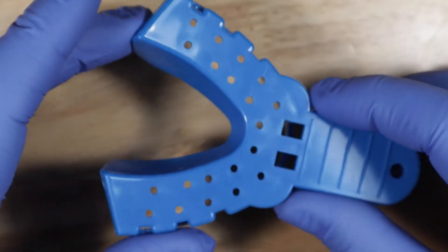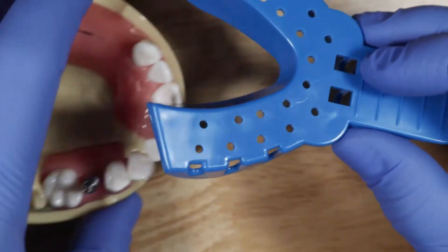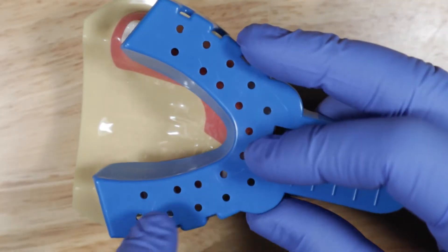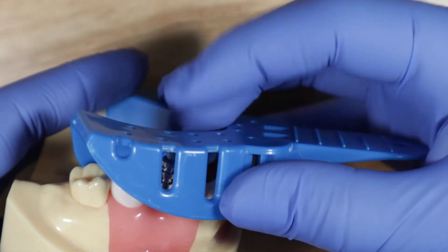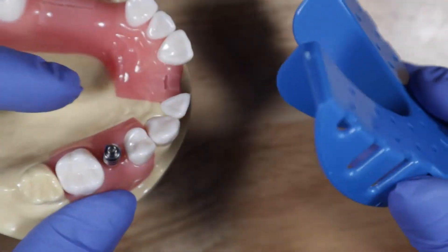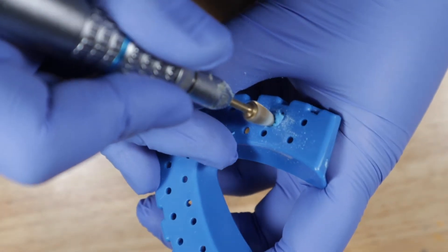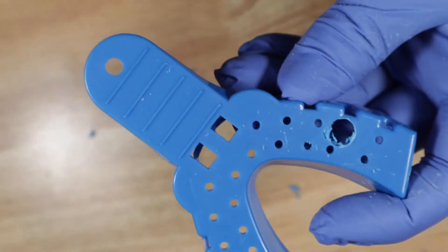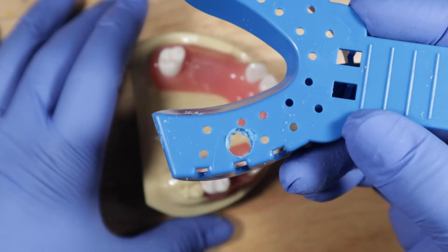Next, get your impression tray. This is a mandibular arch — you'd want to use the appropriate arch for your patient. Put it over the patient's teeth and take note of where that impression coping should stick out from. Peek through the sides to see where it is, and you want the impression coping to be able to stick out through it. Now modify the tray so the impression coping sticks through.